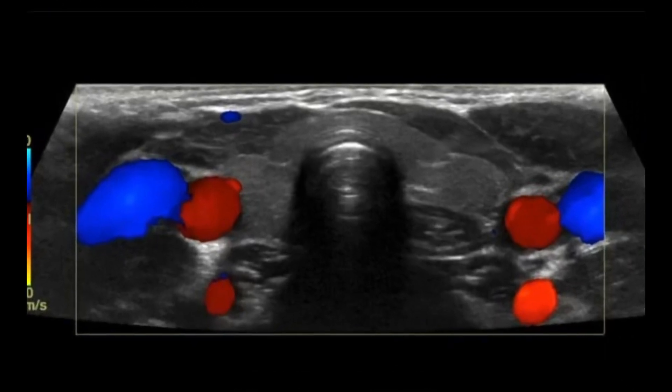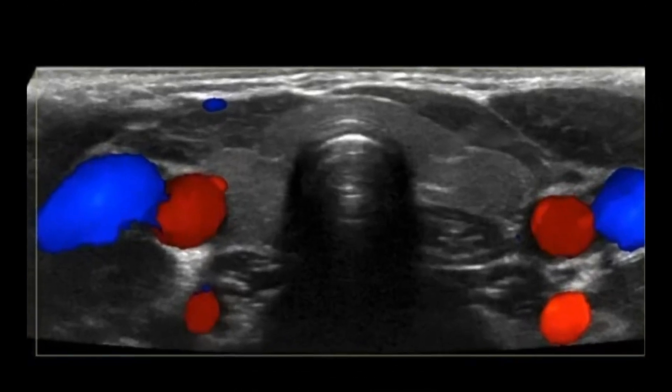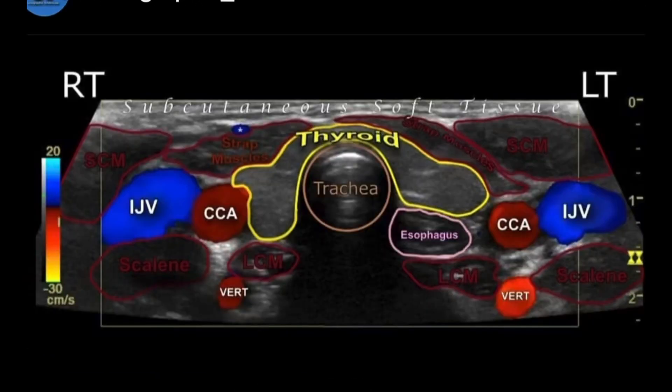Hey everyone, let's go over some head and neck anatomy in transverse. The image we're focusing on is transverse midline at the level of the thyroid.